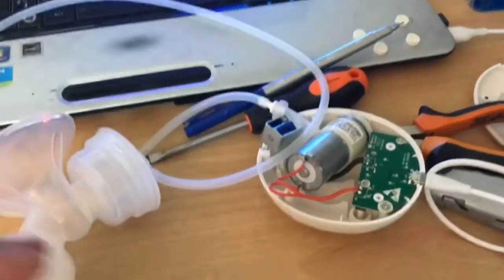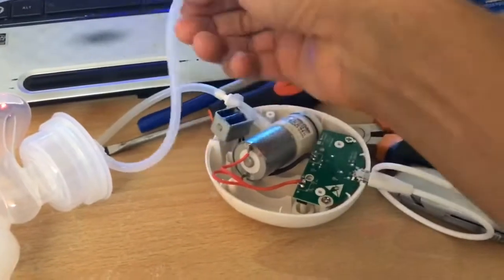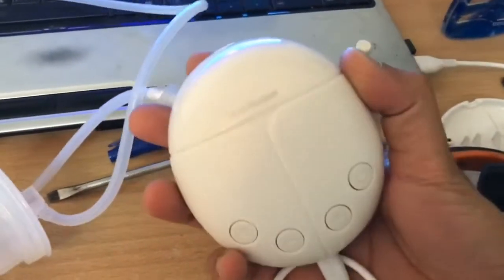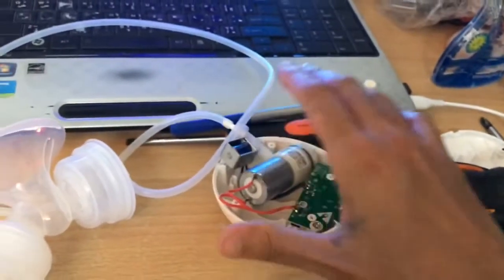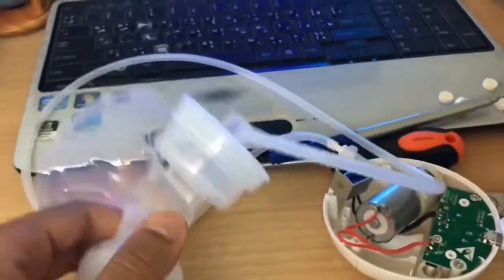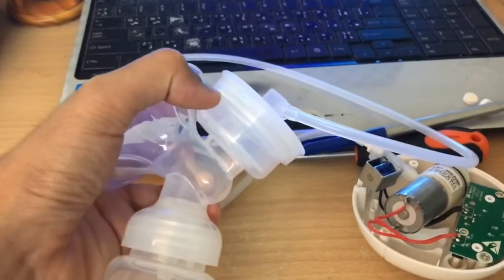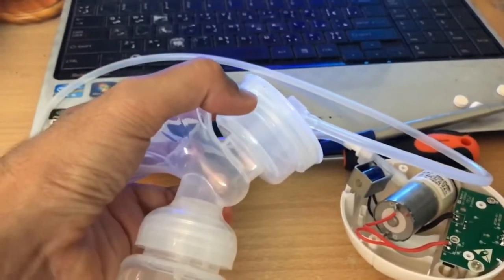Hello everyone, I bought this real booby online and I've heard very good reviews about it. Unfortunately, when it arrived and I started using it, it had a problem — it starts sucking but never releasing. It just sucks and sucks until it gets stuck, with no release.